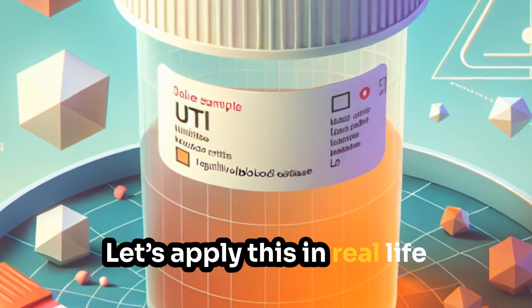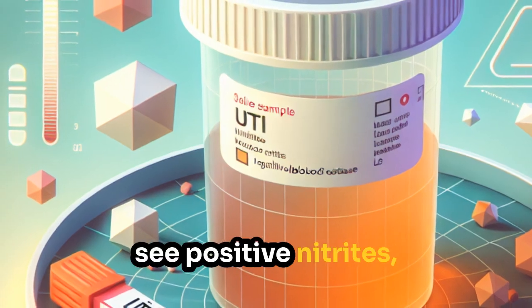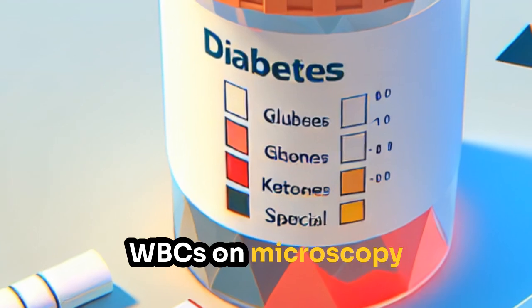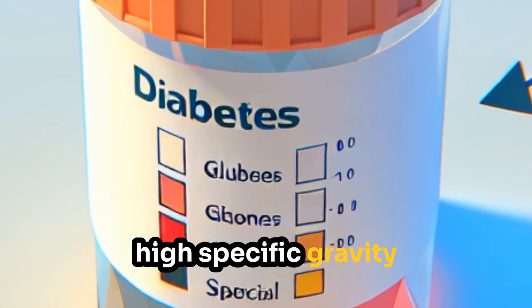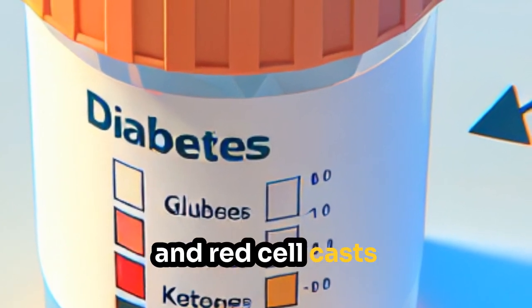Let's apply this in real life. For a urinary tract infection, you'll often see positive nitrites, leukocyte esterase, cloudy urine, and WBCs on microscopy. In diabetes, look for glucose, maybe ketones and DKA, and high specific gravity. Glomerulonephritis, think red cells, protein, and red cell casts.